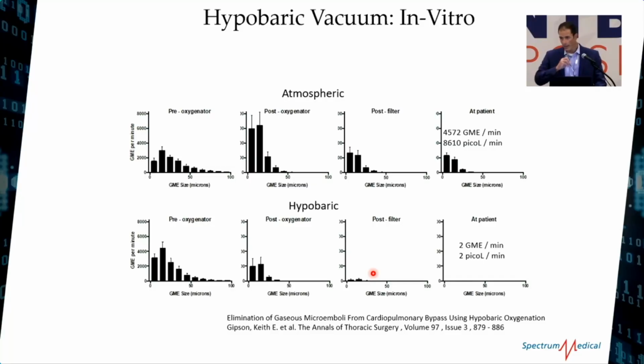Okay, so you're not giving any nitrogen. You create a nitrogen gradient. That nitrogen is exhausting out of the oxygenator. So in the first couple of cardiac output cycles when you go on, you can basically denitrogenate the patient's blood, and then you create a full hypobaric circulation in the patient so that any gas bubbles or gaseous microemboli that are traveling around inside the patient can reabsorb back into the fluid state and not wreak harm in the brain.